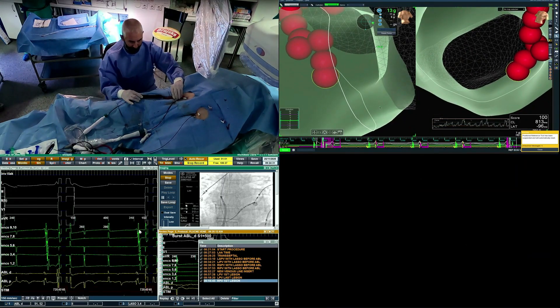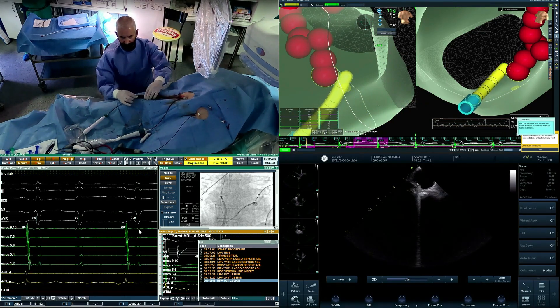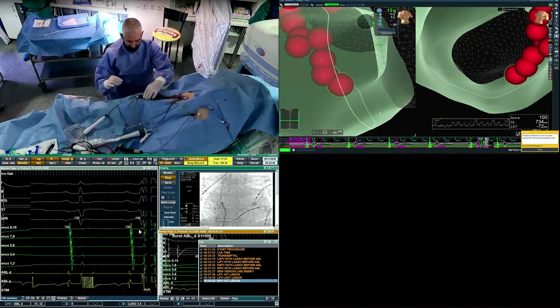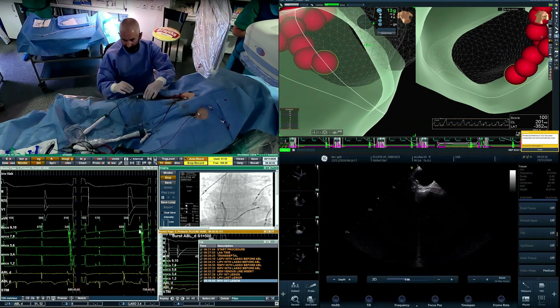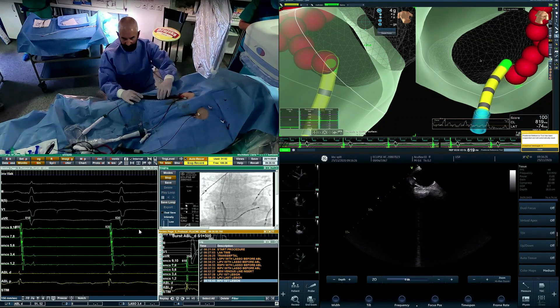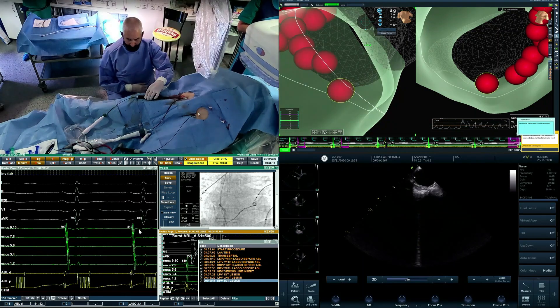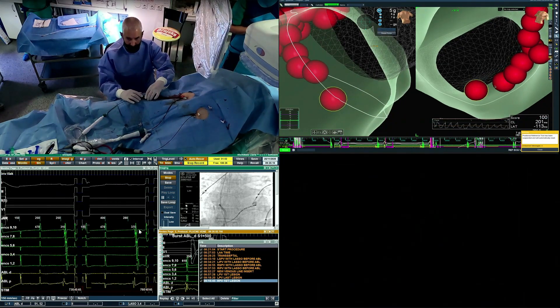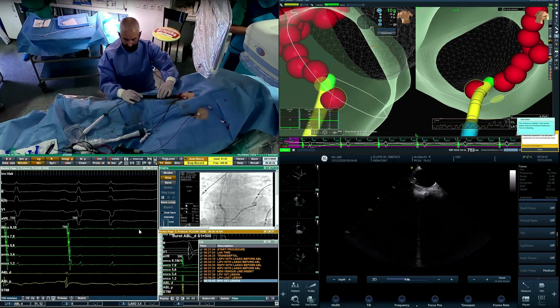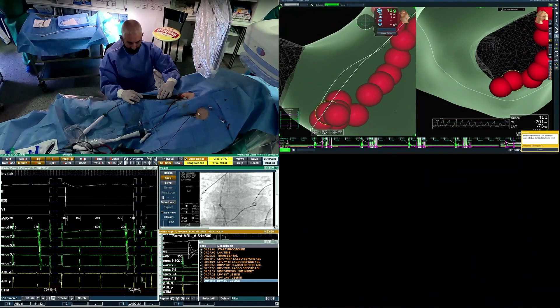We are progressing and doing our posterior line. Depending on the heart rate — since delivery is synchronized with the heart rate — for the so-called high dose, each application takes about six to seven seconds. We are repeatedly going through that process: UnGuide on and off, tagging the lesions, trying to connect all of them to make contiguous lesions. It's easy to stack them up when there's no coughing. It usually takes less time to encircle the right side, mostly because we're not facing coughing problems.